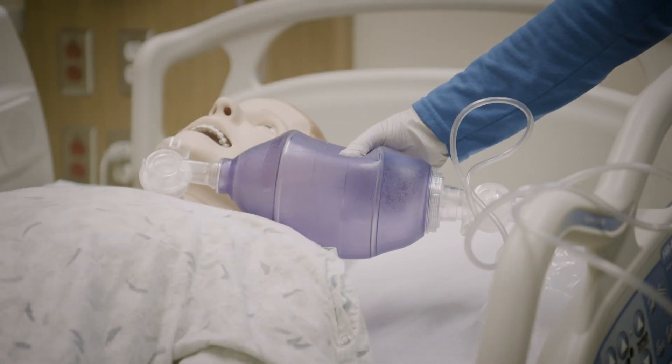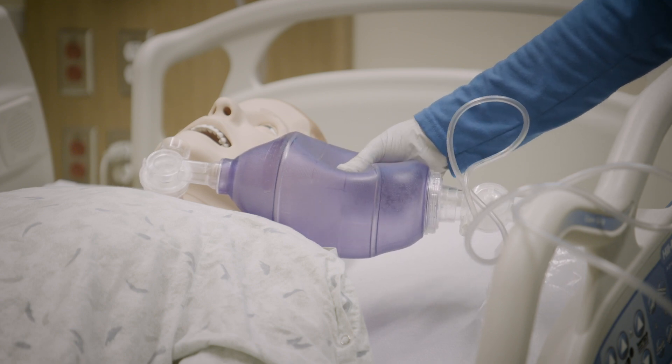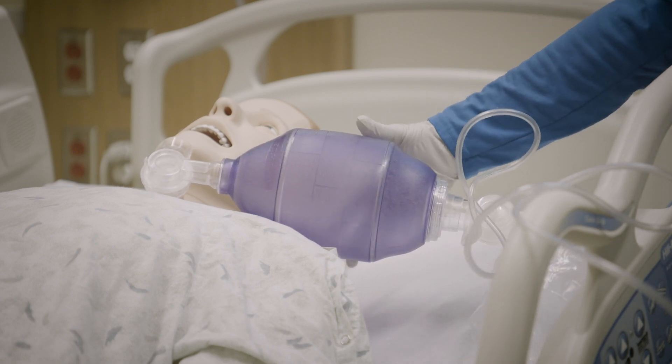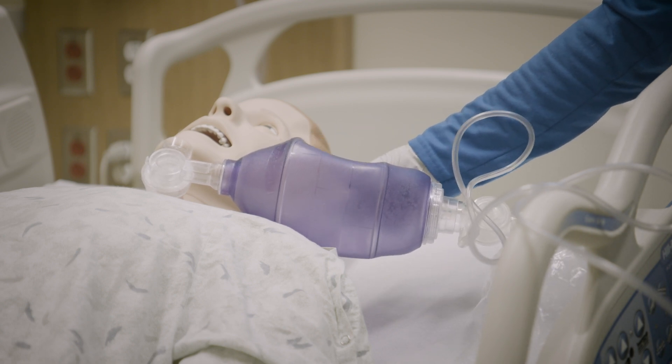After oxygen is connected, continue to breathe for the person, squeezing the bag every 5 to 6 seconds. Remember, ventilation is different than oxygenation.